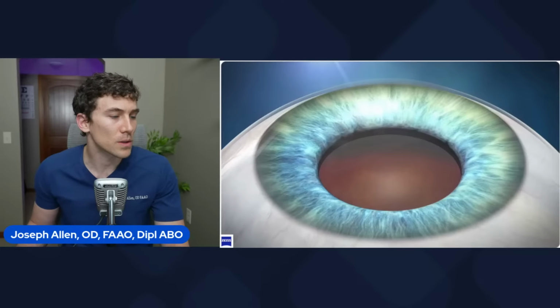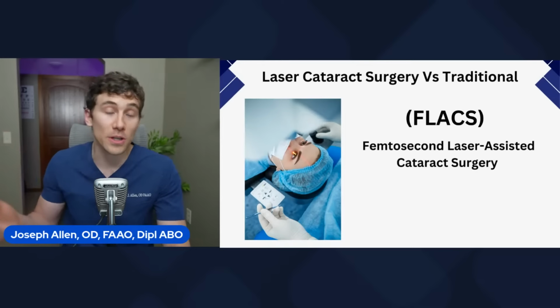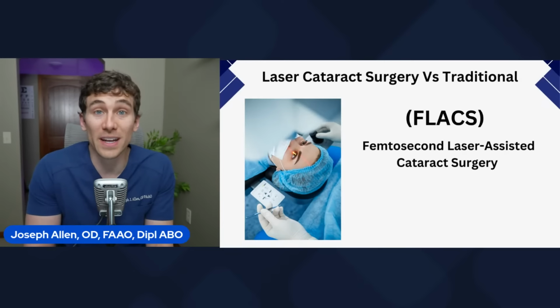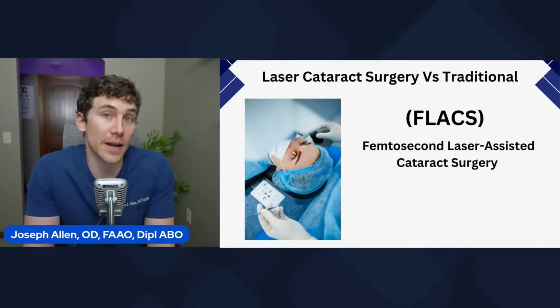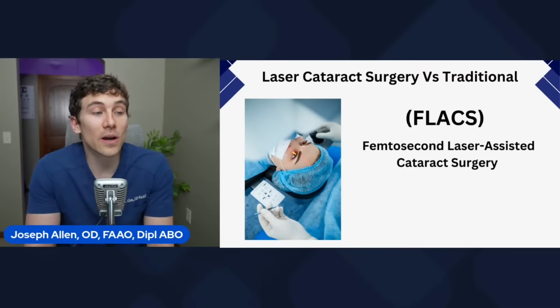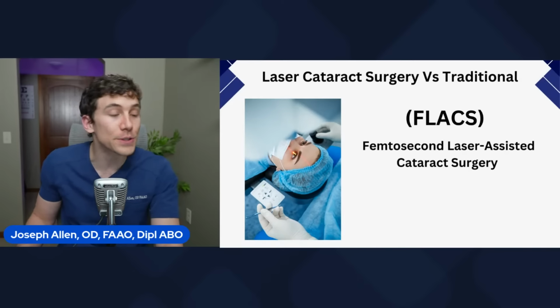So what are our options? So that's traditional cataract surgery. One of the other things that you'll see oftentimes talked about or recommended, I've even seen billboards about this, is something called laser cataract surgery. And so a lot of people ask, what's the difference between traditional and laser cataract surgery? In the eye care world, we call this FLACS, for femtosecond laser assisted cataract surgery.